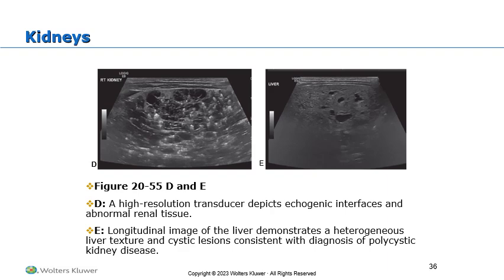Here's another example. This one actually demonstrates some more cystic appearing areas, but we don't really know if those are necessarily cysts because we expect more microcysts. Those could be areas of necrosis.